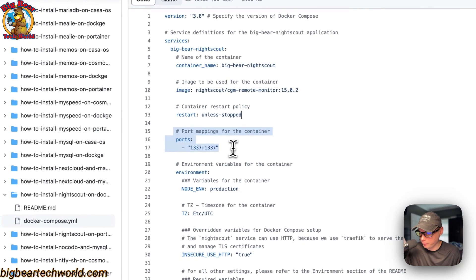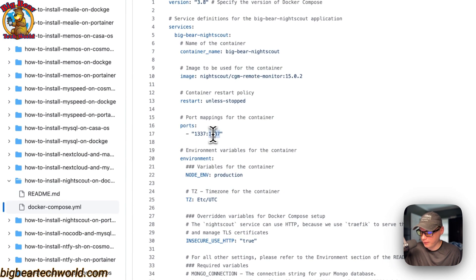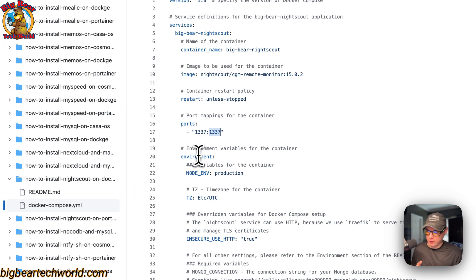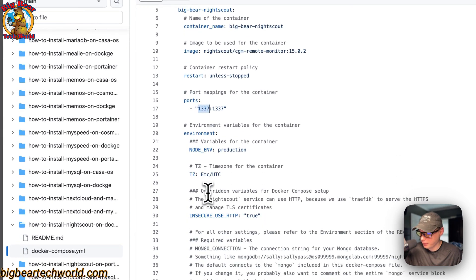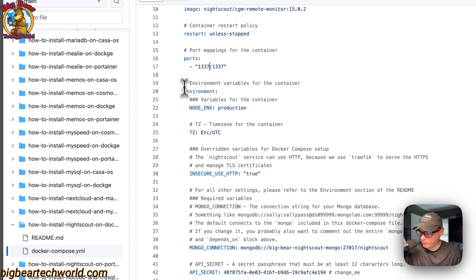Port mapping: 1337 is on the host side. If this collides with another port on your host you can change it. On the container side it is also 1337 — do not change the container side, you can only change the host side.